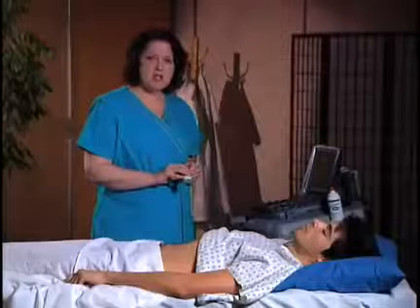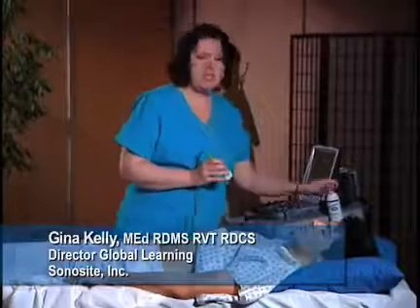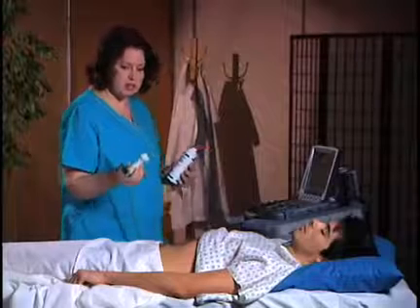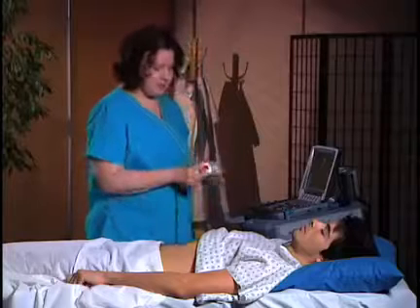Another examination you can do in the ED is the evaluation of the kidney for nephrolithiasis. This is a relatively easy examination to do. We're going to do it, again, using the phased array transducer, your all-purpose ED transducer. And the first view that we're going to look at is a sagittal view of the kidney.